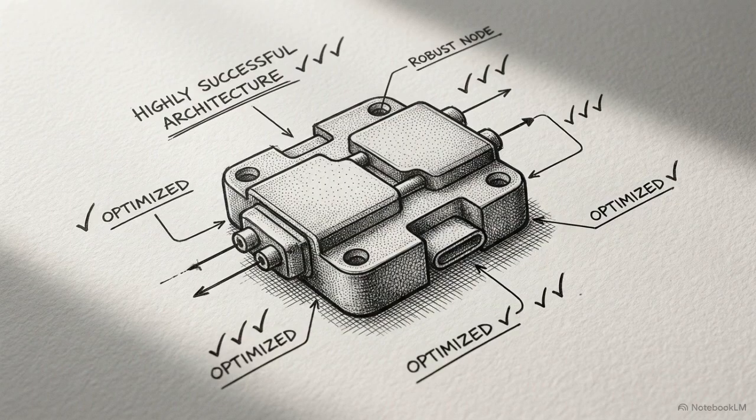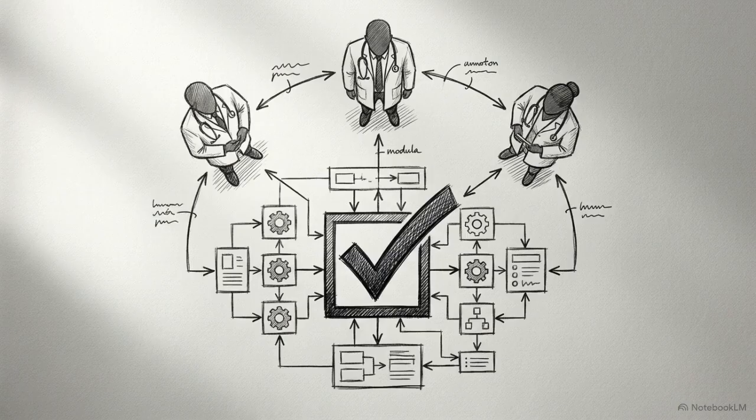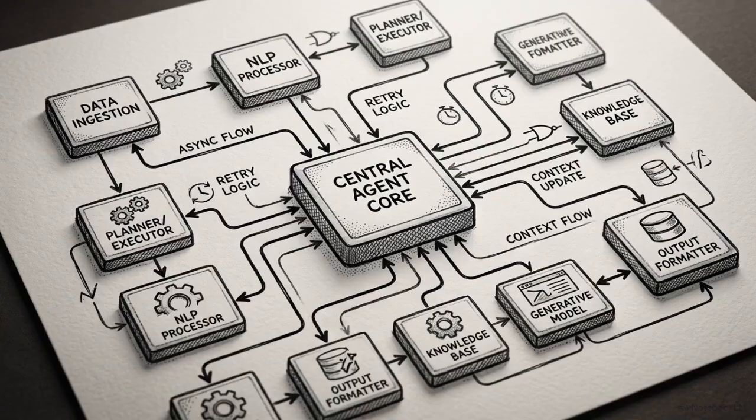Rad.1, an agentic vision language model, emerged as the most successful system in the clinical acceptability test. It was the preferred model for all 3 human readers, reaching an acceptability rate of 75.5% without requiring modification. This performance is tied to its agentic architecture, which acts as a coordinator rather than attempting to process the entire diagnostic task in one step.